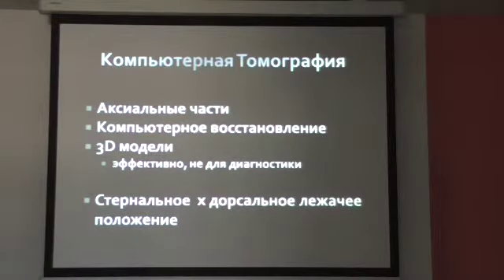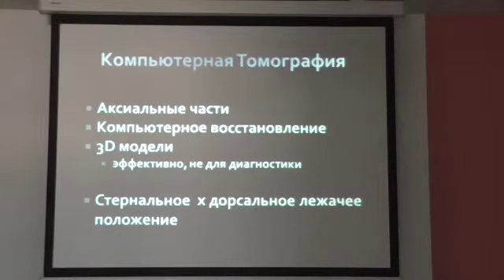So, when we move to computer tomography, I would want to recommend it, though not for all animals. However, in case of retrobulbar abscesses or maxillary abscesses, I could recommend it. So 3D models, you could even do 3D models.